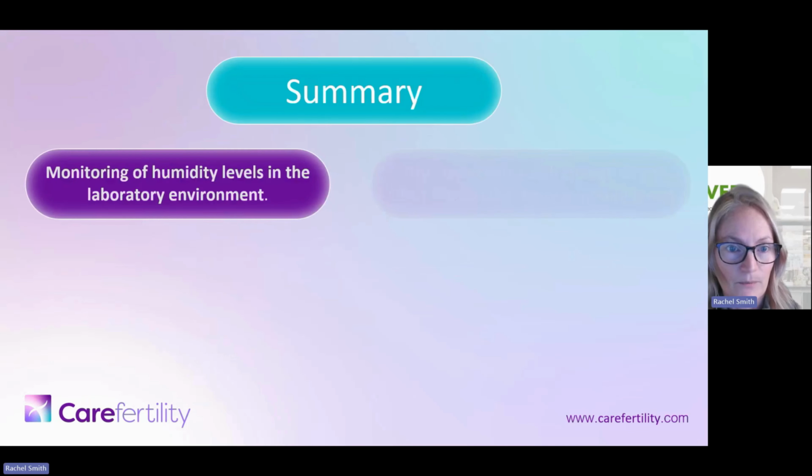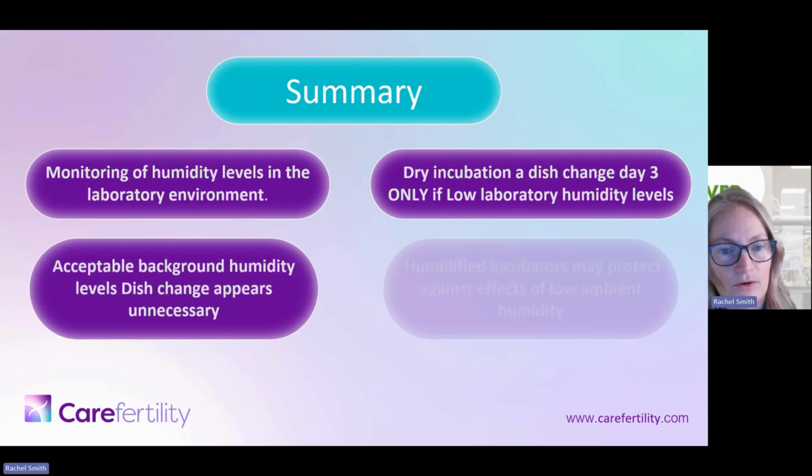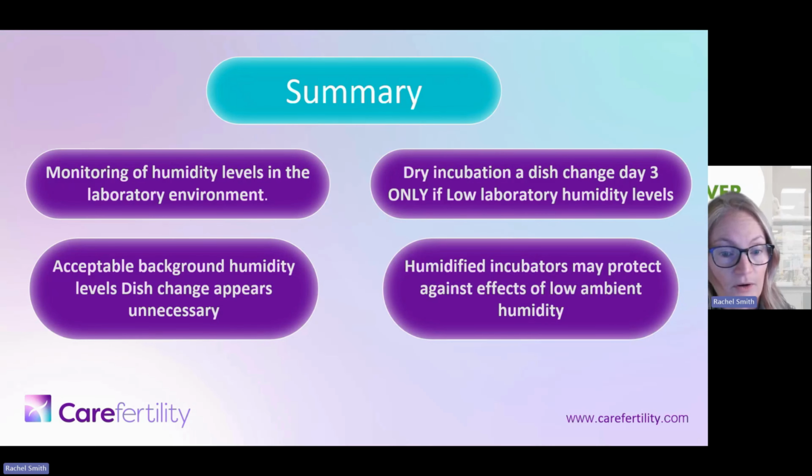So in summary, we would advocate that monitoring your humidity levels in your laboratory environment is essential to be able to understand changes over seasons and in certain circumstances where an action might be required to ensure that the osmolality in your culture media is maintained over the course of your embryo culture. Acceptable background humidity in a dry environment for incubation would suggest that a dish change is unnecessary.